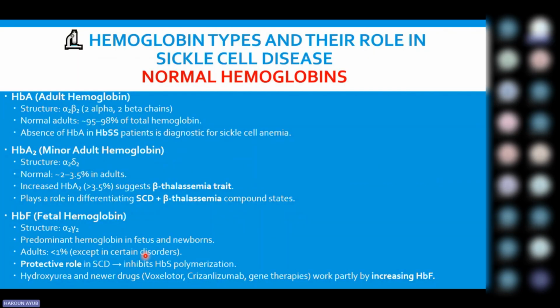So at the lab, you'll find that once you did the first diagnostic test and the patient was confirmed either a complete sickler or an AS trait, after, let's say, 3 months, 6 months of therapy, mostly in our region we are using hydroxyurea, you'll find that this particular number usually goes up, the HbF. So if the HbF goes up, it limits the HbS, meaning that the patient is responding.